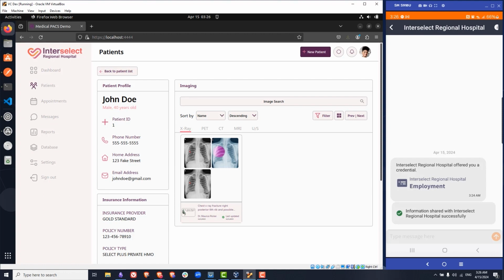The credentials provide the bridge where the user holds them on their device and carries them from whatever organization they're from to whatever organization they need to access. And that can dramatically reduce the network complexity of integrating lots of different organizations. And if you can reduce complexity and enhance trust, then you can save a lot of time and money and confusion and enhance security.